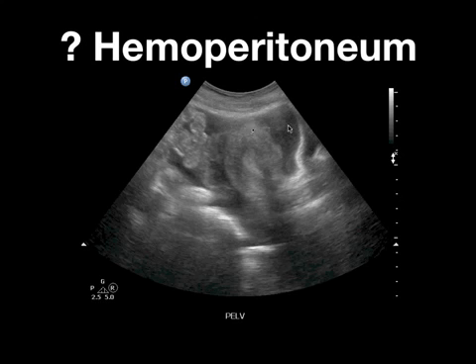Now it seems anteriorly there's an anechoic area here, so you would think maybe this is the urinary bladder. But there is no wall abutting up against this side, and you can see that this anechoic area extends along here and over into here, and you can see that there's nice sharp triangular corners as what turns out to be a large fluid collection abuts with the bowel.